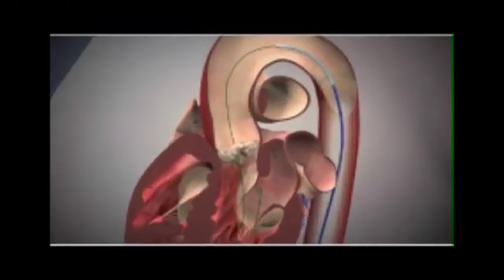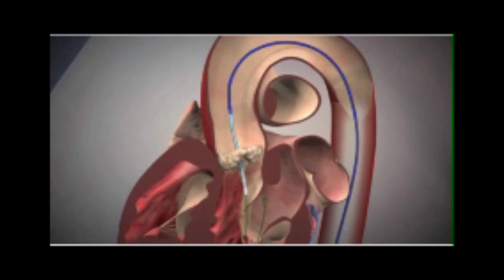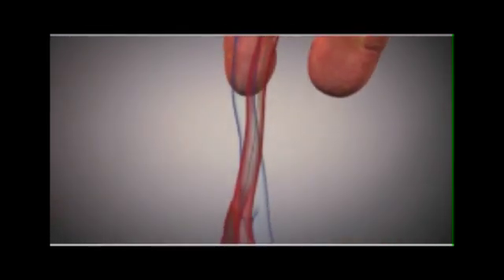Once we've crossed with the wire we can track a balloon and position it in place within the valve that's severely narrowed, and we can inflate the balloon thereby dilating the valve and creating more room for our later implantation.